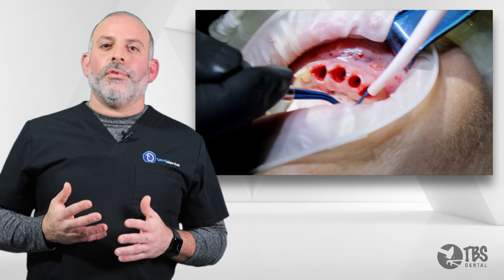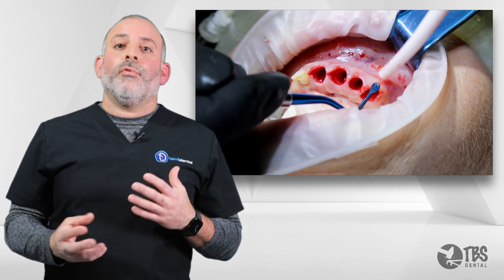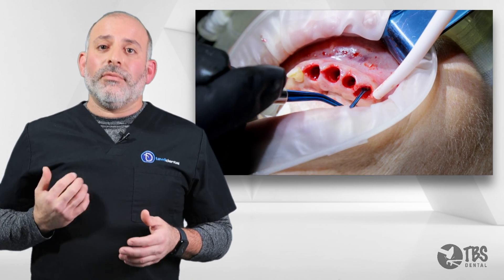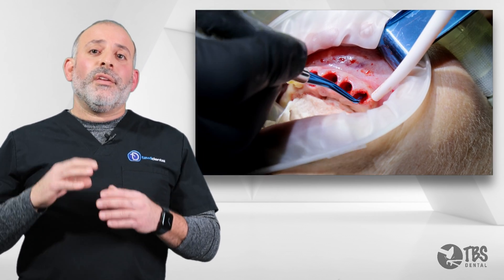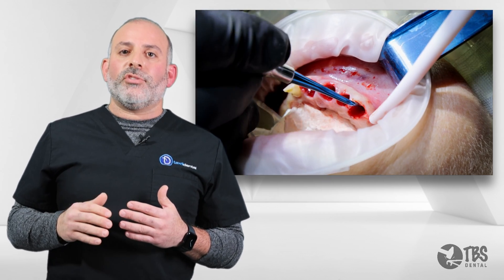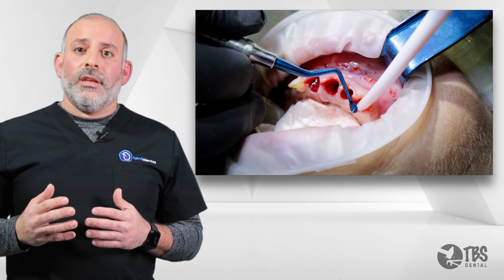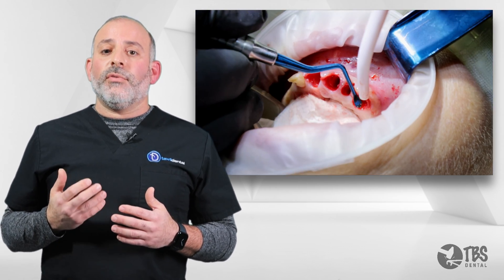Now that the teeth have been delivered, we have to clean the site for either blood clotting or for bone grafting. The common misconception is that we should just scrape up and out. But utilizing the serrated curettes from TBS, we can actually do a different type of concept — instead of just pulling the granulation tissue out, we can push down into the extraction site to help separate the granulomatous tissue, and then begin to scrape out against the bony walls to deliver the granulation tissue.